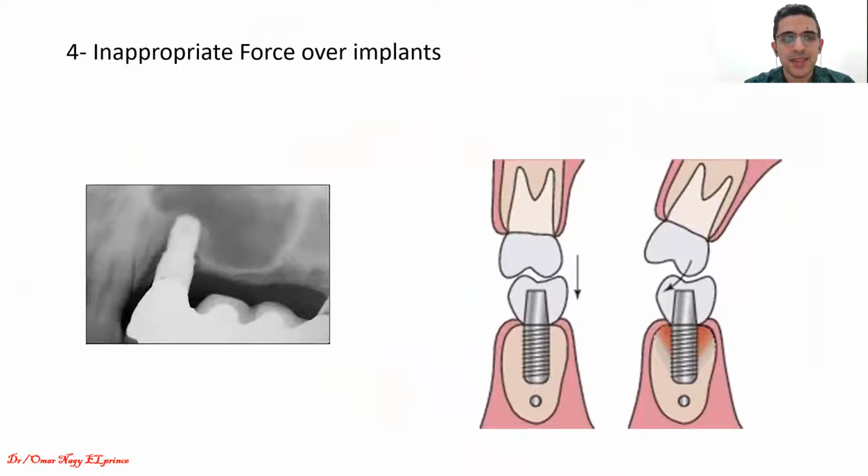Well, يعني دي يمكن واحدة من الحاجات اللي احنا بنشوفها كتير جدا، خصوصا among oral surgeons like me. دايما بنشوف ان ناس كتير جدا بيبقى همهم الاول والاخير هو الامبلانت placement, and they don't consider the prosthesis. Okay, actually the prosthesis affects implant stability and survival rate a lot.